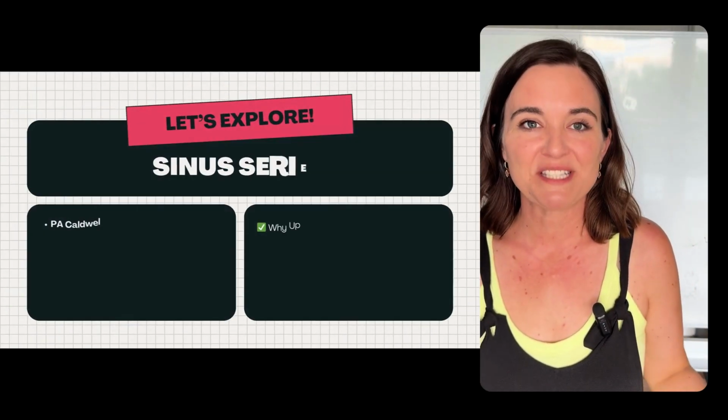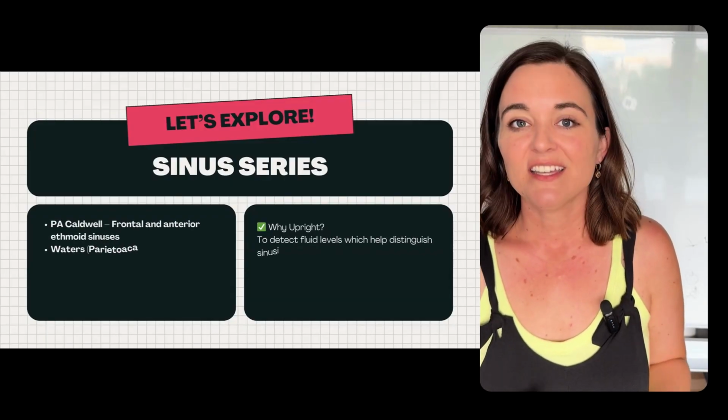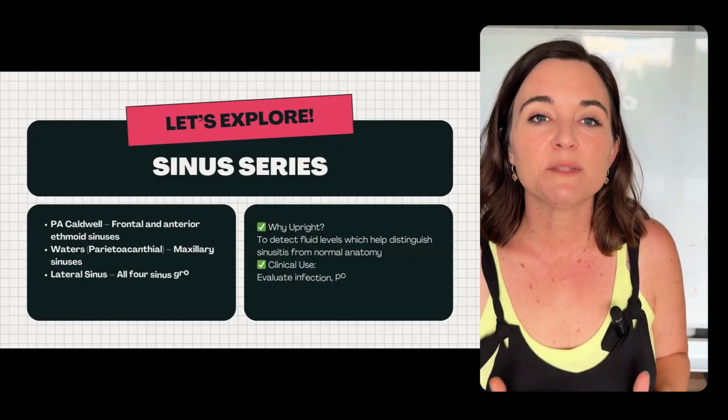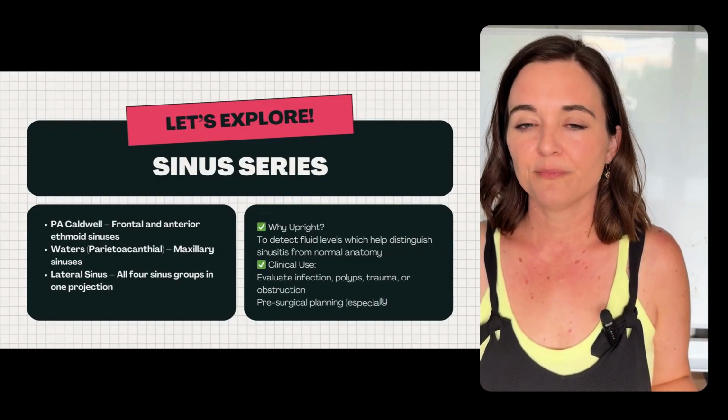All right, next up is sinuses. Here's where positioning is everything. Sinus imaging is all about air fluid levels, so these must be done upright unless absolutely contraindicated.